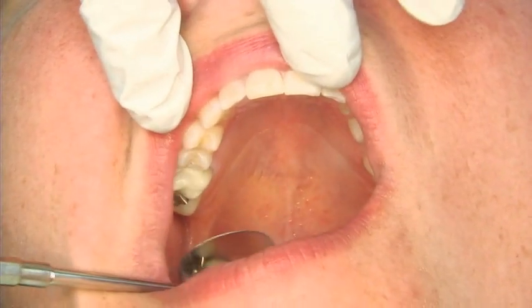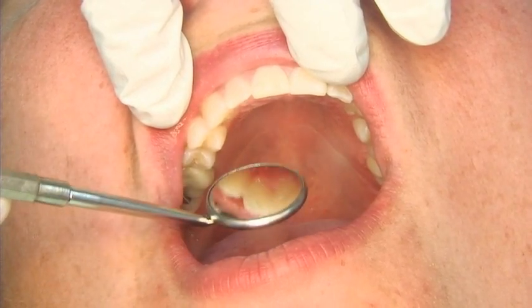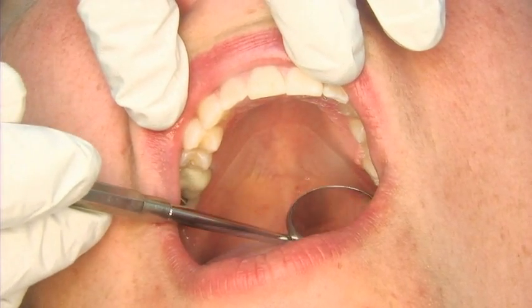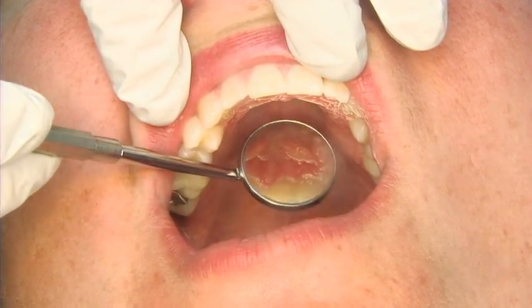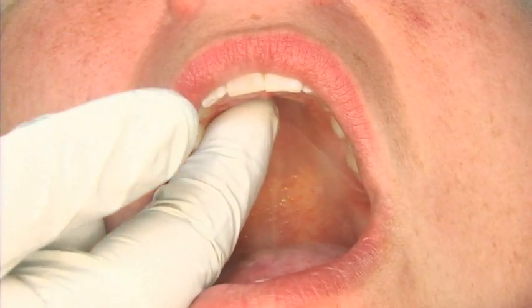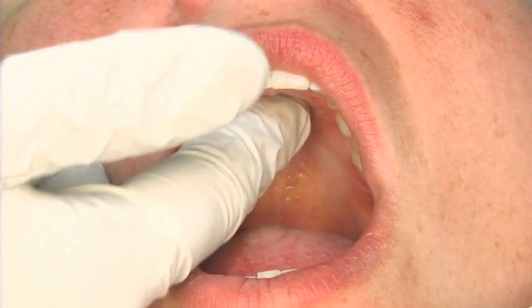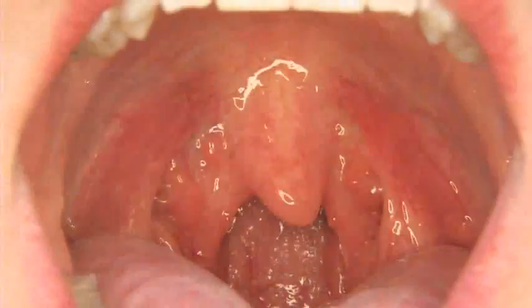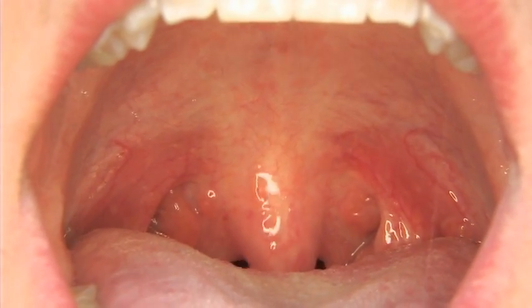Identify and try to explain any submucosal swellings. The hard palate is the most common intraoral site for minor salivary gland tumors, which could be benign or malignant, and is also a site where lymphoma can occur. Smokers may have nicotinic stomatitis — a white, wrinkled palate with red dots. Torus palatinus is located on the midline and is stable once formed. A nasopalatine canal cyst is located on the anterior midline and might leak a salty fluid. A good view of the soft palate, uvula, and tonsillar pillars is worth the effort, as tumors here often go undetected.